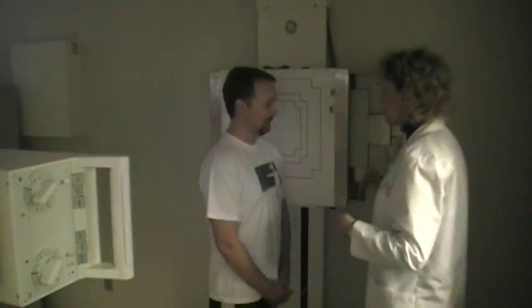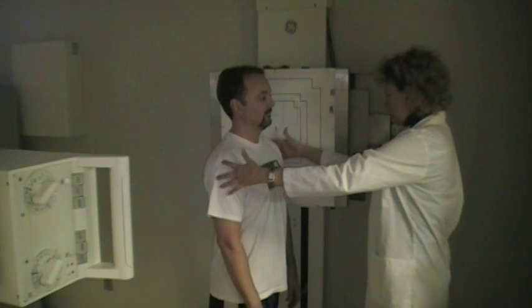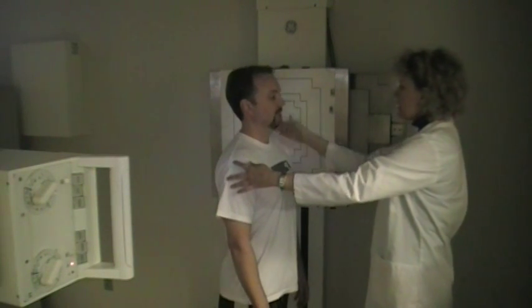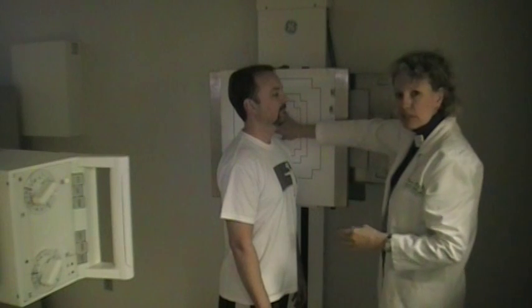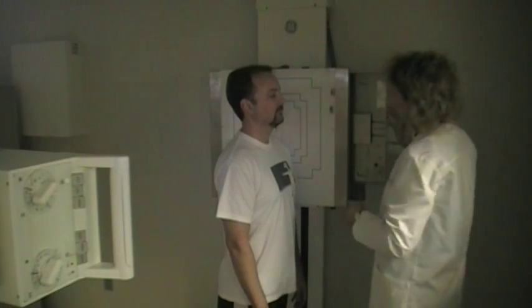Okay, we're going to be doing the cervical spine imaging, and what I'm going to show you is typically the routine cervical spine that you'll be experiencing out in clinical site. First, I'm going to start with the lateral C-spine on an ambulatory patient, and you have the patient turned sideways so that the left shoulder is touching up against the board. Have them step towards you just a little bit so that you can get the neck centered to the center cell on the bucky tray.